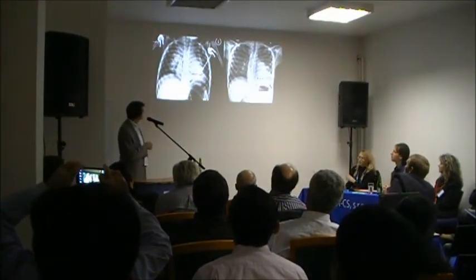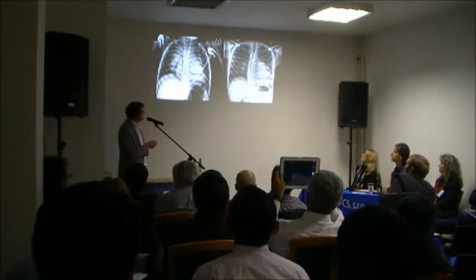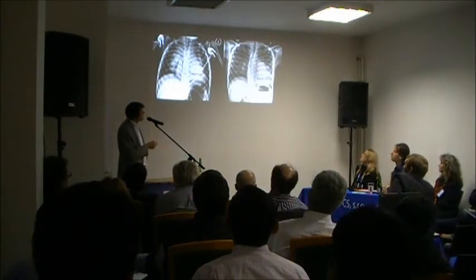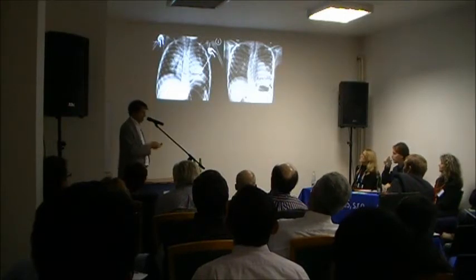This is one patient. We put in a bronchial stent there from birth. 4 years later, the child's at home well, but has metal in the airway. The rest of the airway has grown. This has never been ballooned or stretched or dilated, but it's there for life.